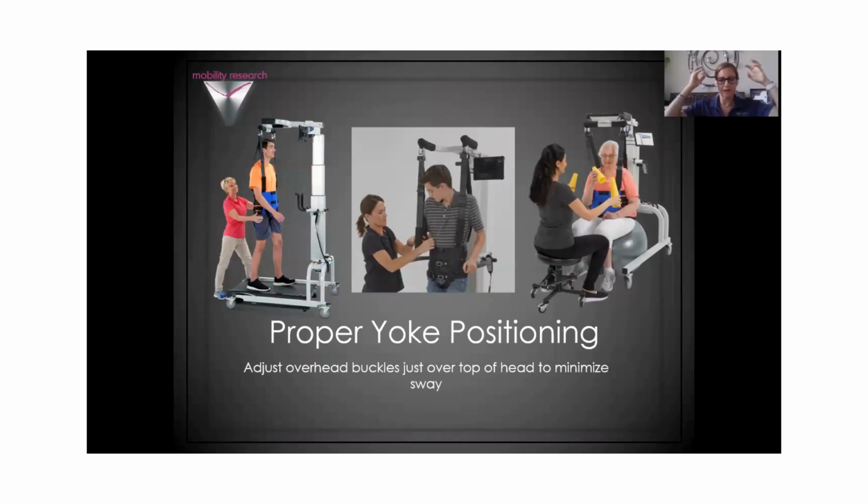One of the benefits of the LiteGait is the yoke position. So the ability to position that yoke or that support system right above the user's head. The closer the user is to the support, the more stable the system. So if I'm attached to a support system, say on a ceiling track, and there's 5 feet of line between me and that support, even if that support is stationary, that's still 5 feet worth of sway that's available to me. So for your lower functioning clients, that becomes a much less stable system. With the LiteGait, we can control where the yoke is positioned above the user's head and create more stability.